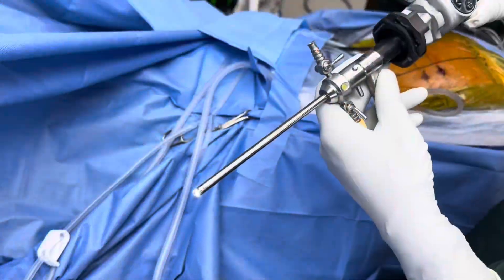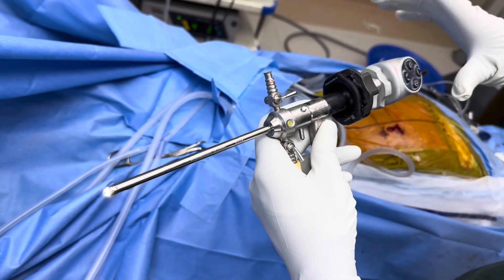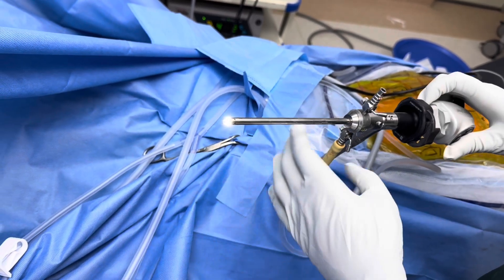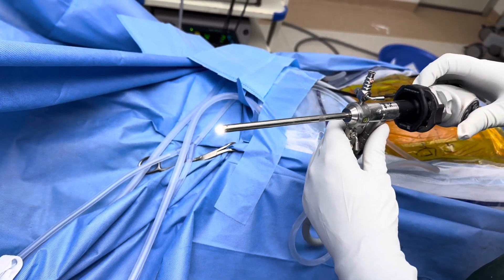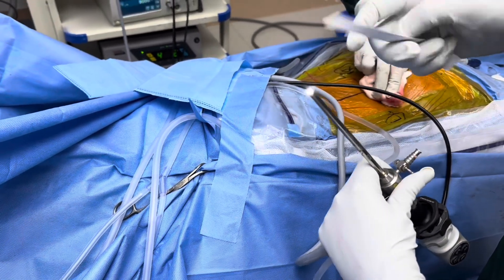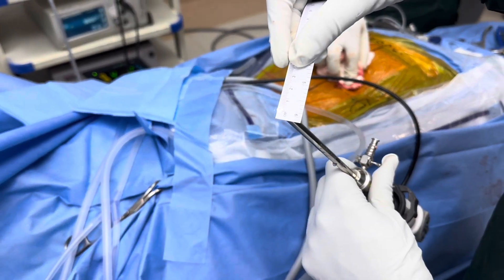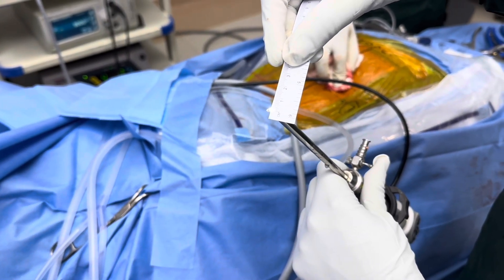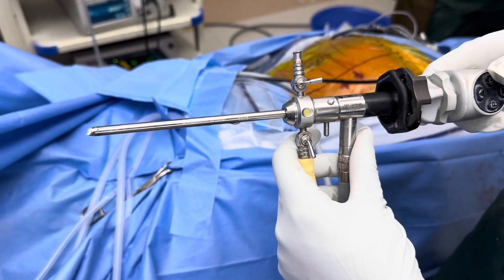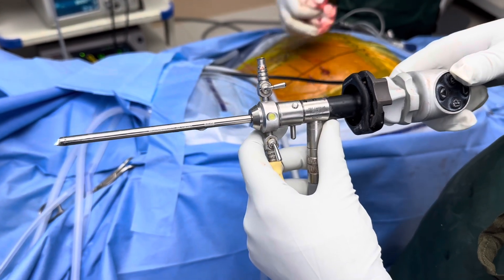This endoscopic surgery is done through this small scope. The scope diameter is approximately 0.7 centimeters, which is 7 millimeters. This surgery is done through a 7 millimeter scope and this scope goes into the spine.